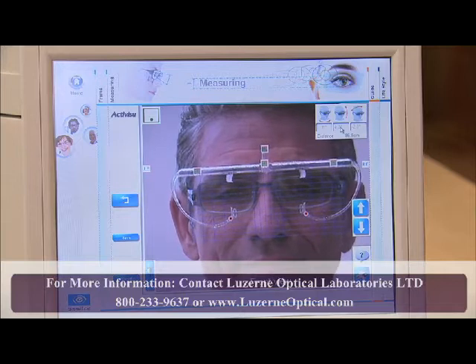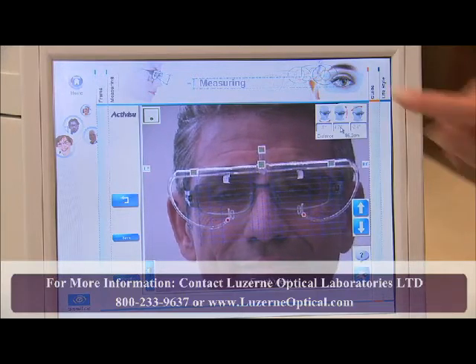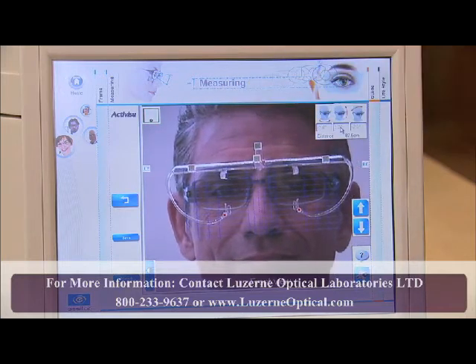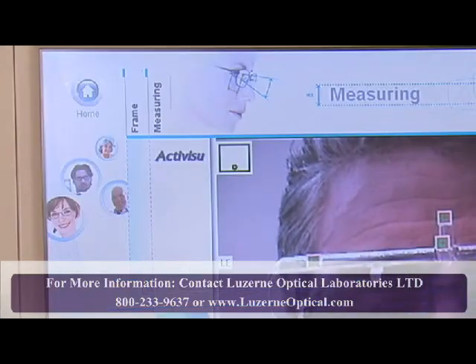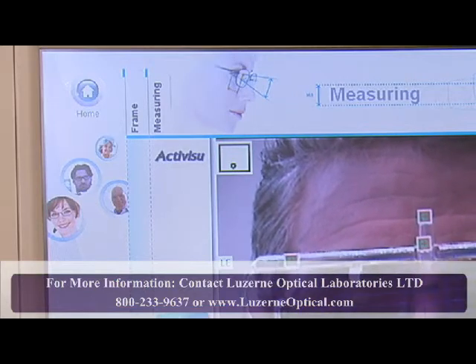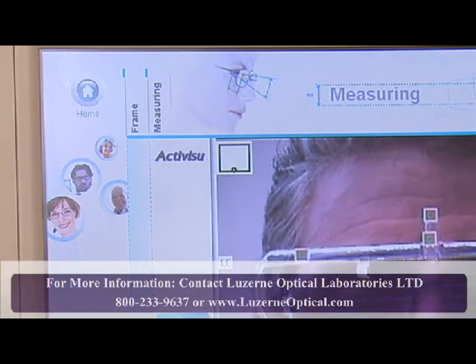Make sure the patient is standing or sitting using a natural posture, then check the position display on the top left of the screen. The patient will be represented by a red dot if he or she is out of position, and a green dot when in the correct position. Before measuring, the green dot must be inside the box.